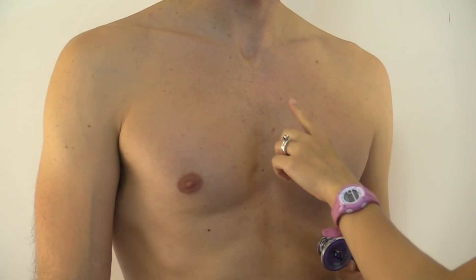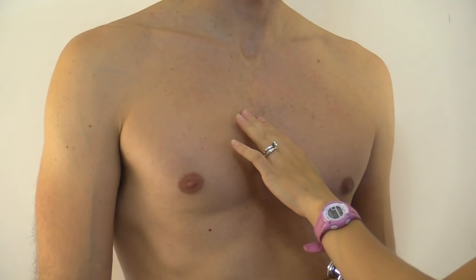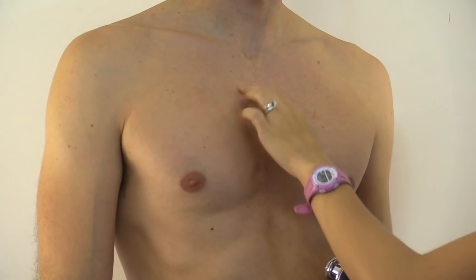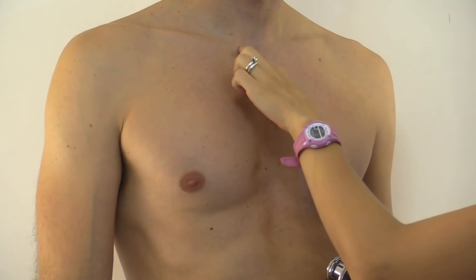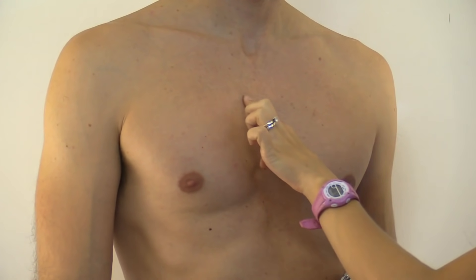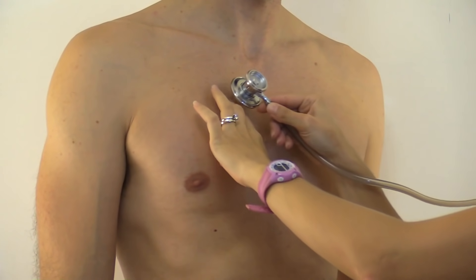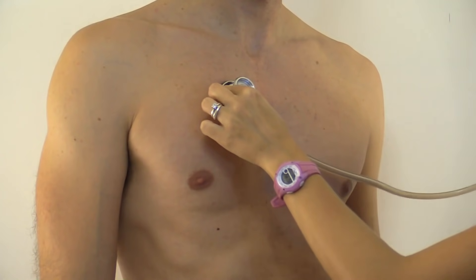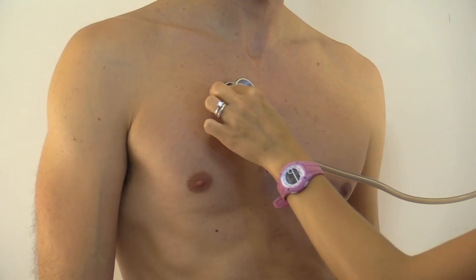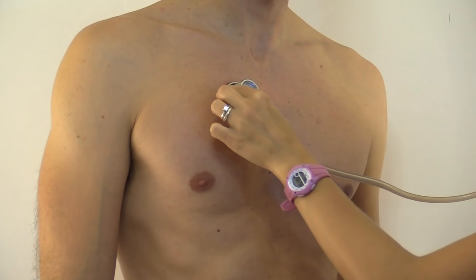Using the diaphragm, we're going to listen at the right of the sternal border at the second intercostal space — that's the aortic valve. To find the second intercostal space, find the sternal notch, go down to the angle of Lewis, then go a little bit to the right. We're listening for lub-dub, S1 and S2, and S2 — the dub — is going to be louder in this location.